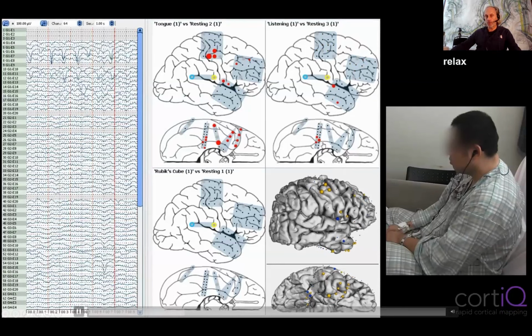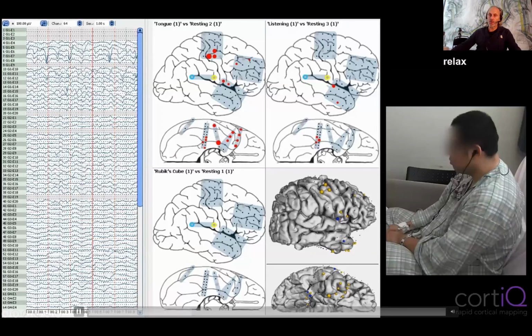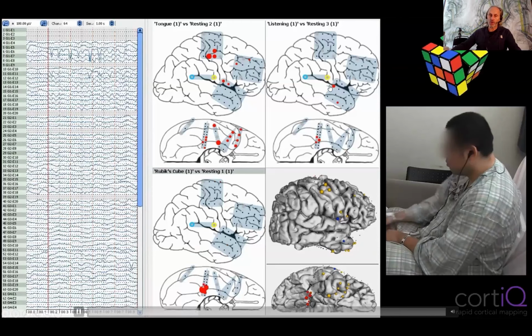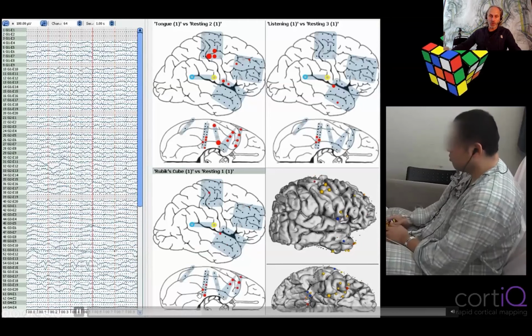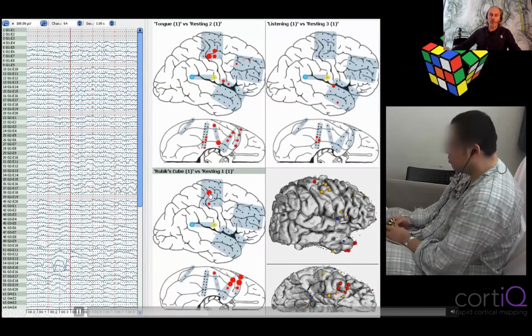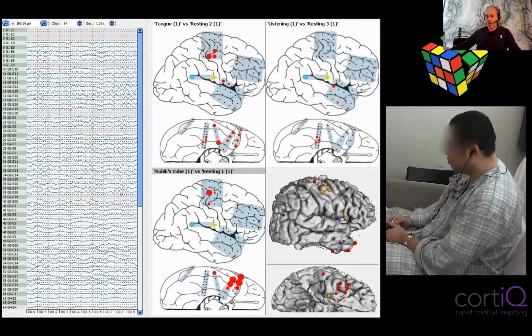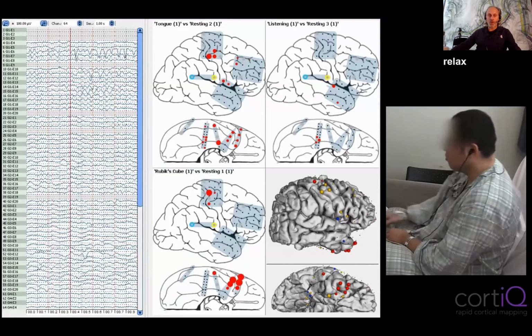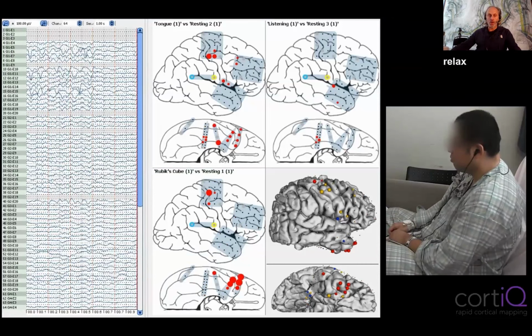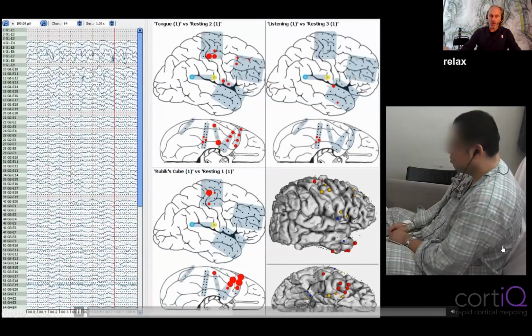Nowadays, we know. So also here the temporal dynamics are super interesting. First of all, here the temporal base is activating. This is decoding shapes of objects, and he has seen the loudspeaker symbol. And then we get auditory cortex and Wernicke's area. This is again the shape region. This is the color region on the temporal base. And then we get an activation of the finger region. So you can just very nicely observe how different brain centers are activated. And this is very useful to understand these networks, especially also for neurosurgeons, because they can plan the surgery much better.